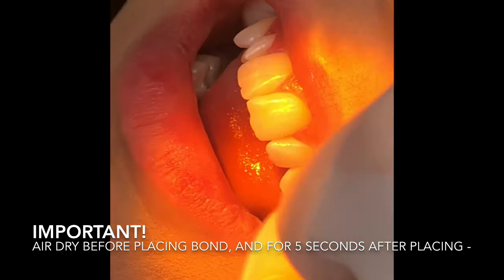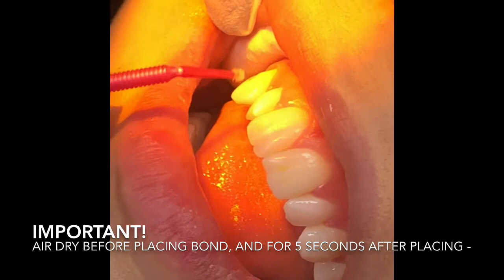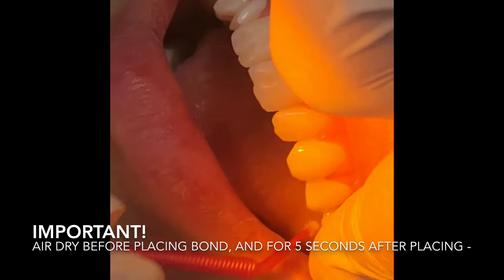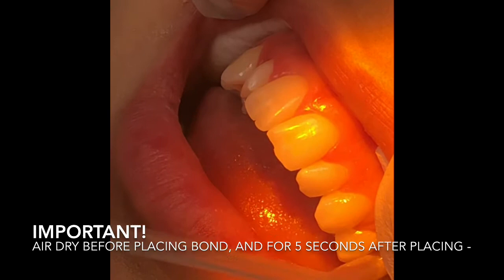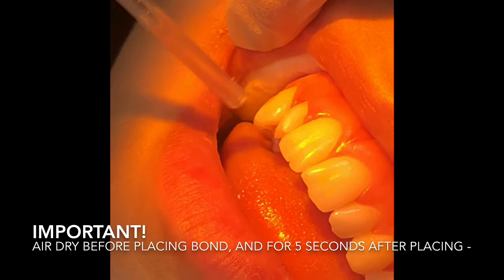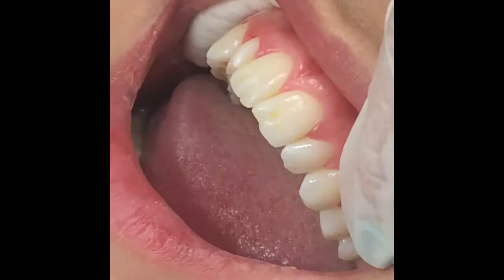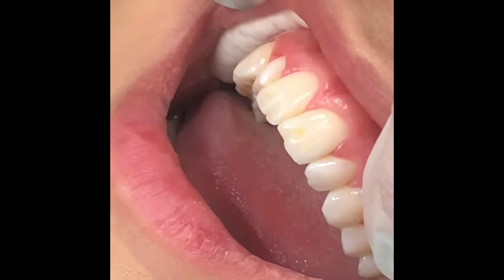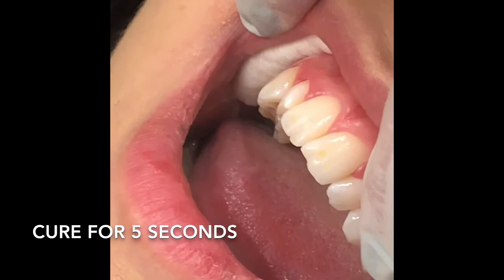Apply a thin coat on every tooth that needs attachments - she's been studying the ClinCheck and looked at the attachment template. The next step is really important: you have to push the bond into the tubules. Apply a lot of air, make sure there's no water in your line - I recommend 10 seconds of solid air on everything. Then she's going to do a brief tack with the curing light - just brief, just a little tack to get that bond a little gummy - and then she's going to seat the pre-filled aligner.